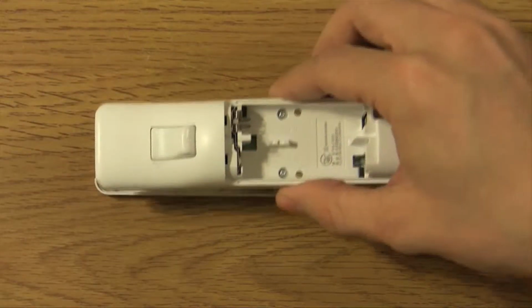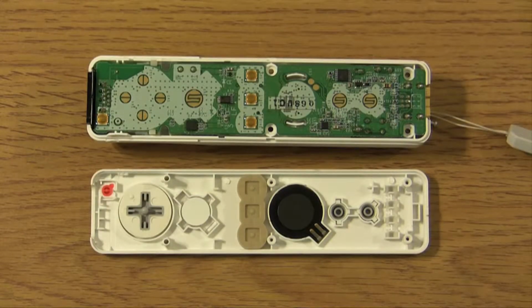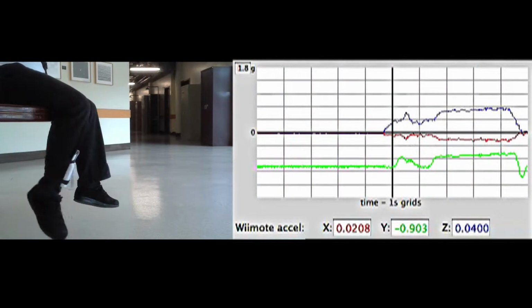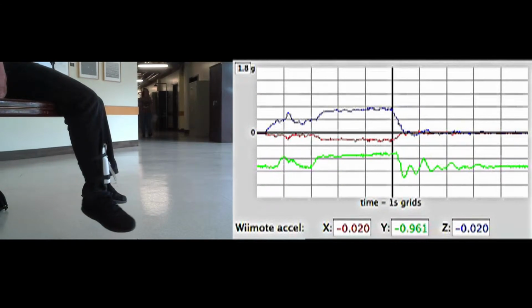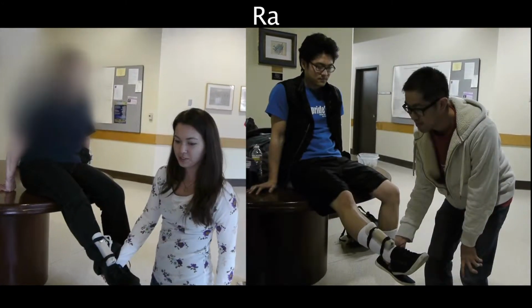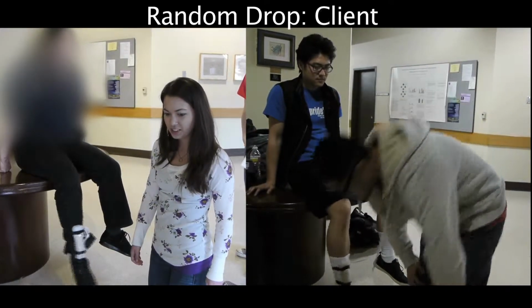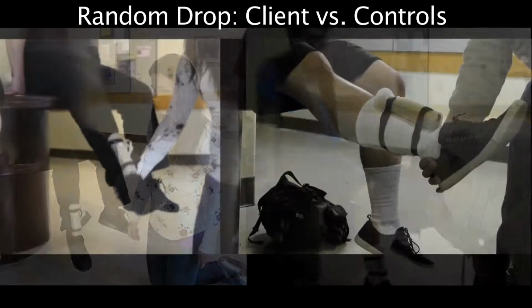While the application was under development, a Wiimote was used as a prototype to record the pendulum test, to administer a variety of tests and collect data. The Wiimote has a 3-axis accelerometer that records linear accelerations in the X, Y, and Z axes. First, we had to make sure the accelerometer was sensitive enough to detect a difference in the pendulum test between a person with spasticity and people without.